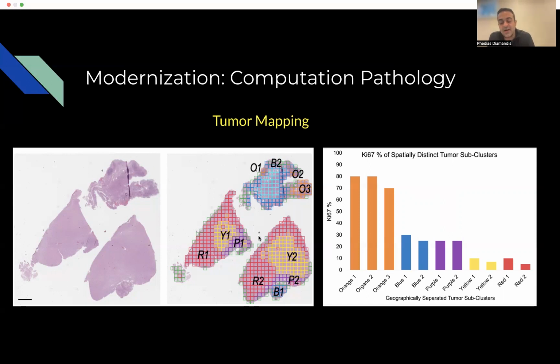and then we can assume that if it's subdividing areas that we thought were tumor into subcomponents, there must be some biological basis for this, because as Virchow said, chemical changes often manifest as phenotypic ones. And so if there's phenotypic changes that we can now precisely localize using automated computer programs, we can now potentially examine these areas differently than other areas of the tumors that have different morphologies.